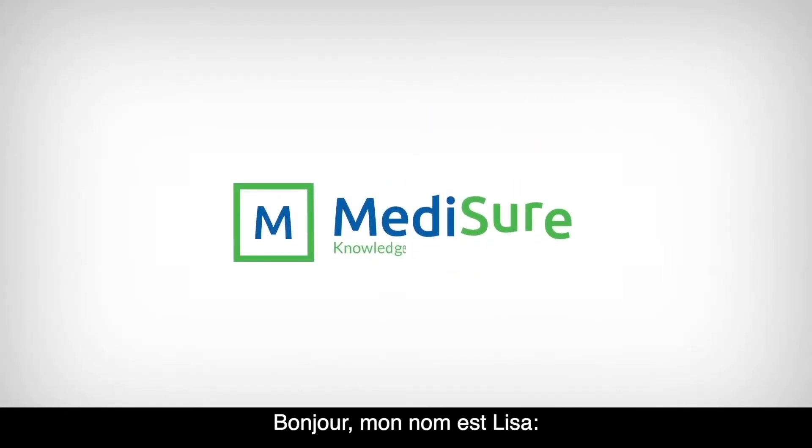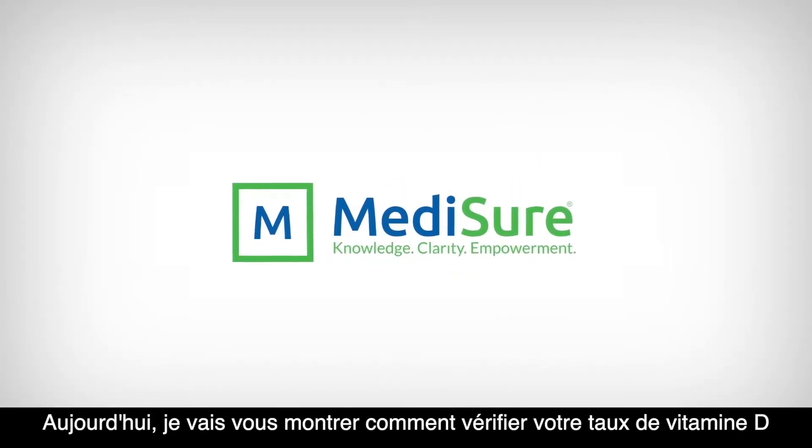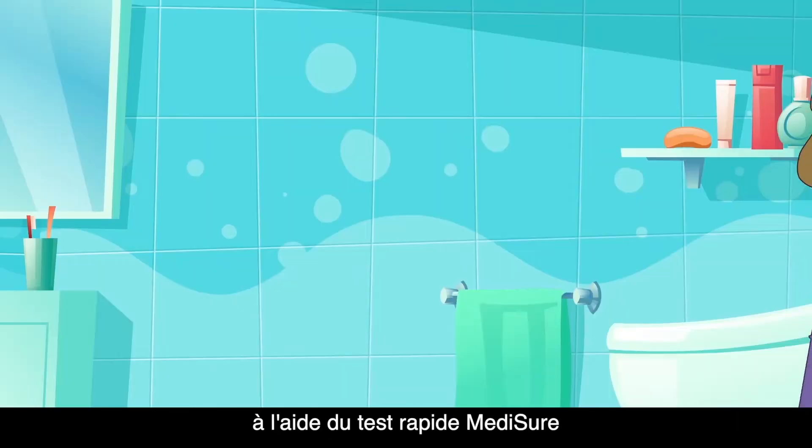Hello, my name is Lisa. Today I'm going to show you how to check your vitamin D using the MediSure Rapid Test.